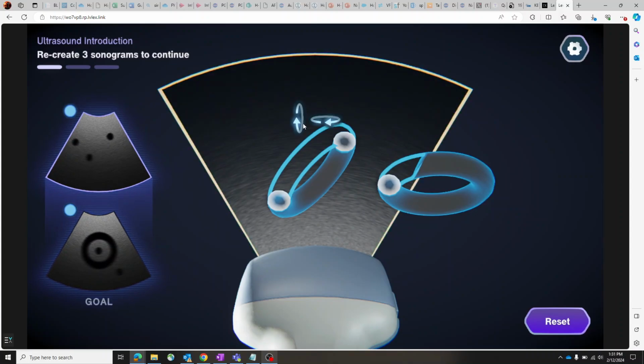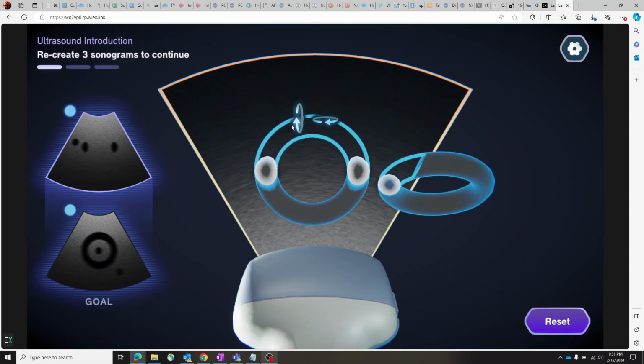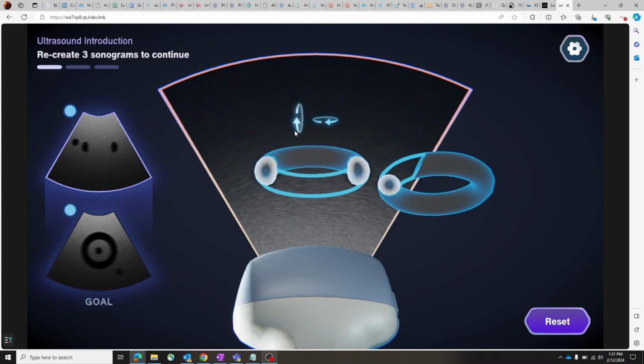We wanted to strike a balance between having too many puzzles, but also increasing the level of complexity as you progress through the game.